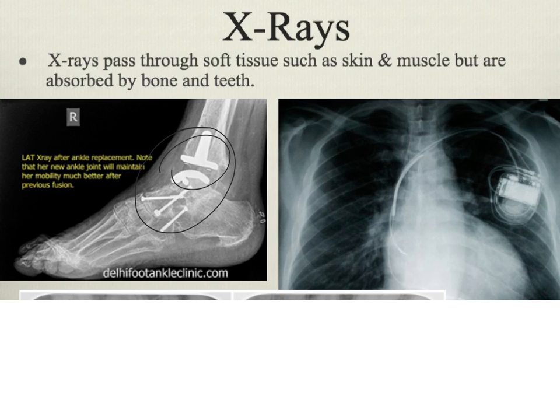Remember, Mr. Bender is going in Tuesday for his full knee replacement, so next time he has X-rays, if he ever needs to have X-rays on his knee joint again, he'll see the metal and titanium that is being put into his knee. And then this is an X-ray showing a pacemaker connected to the heart.